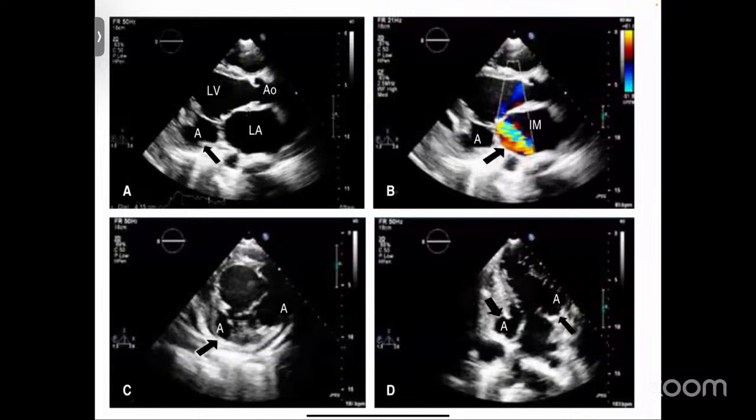This is an echocardiographic image showing the long axis parasternal view with the presence of an aneurysm in the basal portion of the left ventricle. And you can appreciate the severe mitral regurgitation in the color Doppler image in the upper right. And you can see the arrows pointing to the aneurysm that is fistulated in nature.